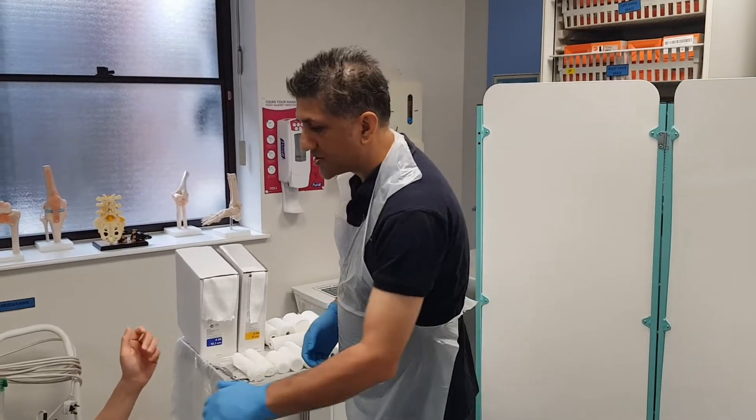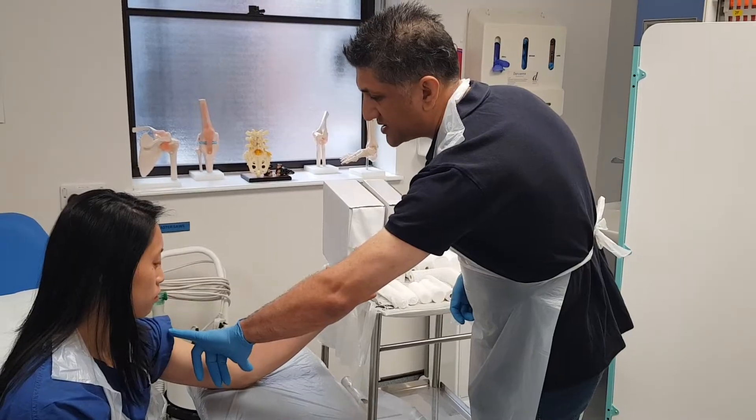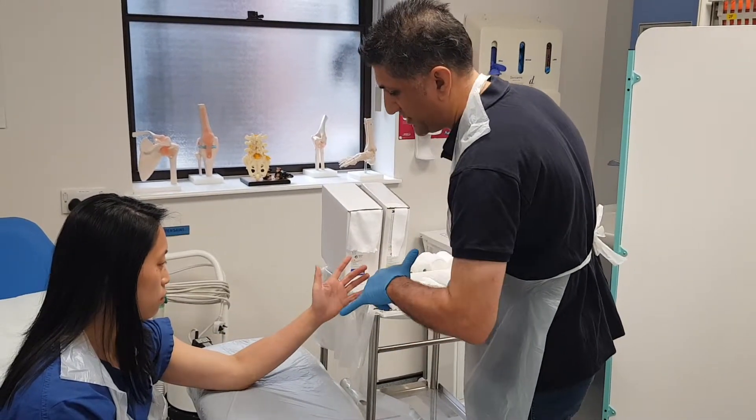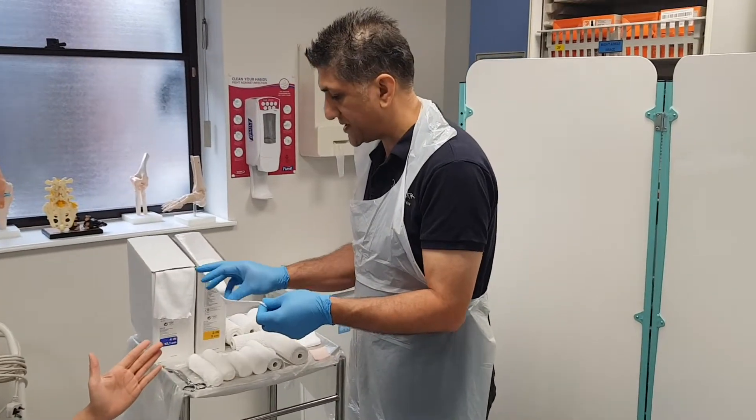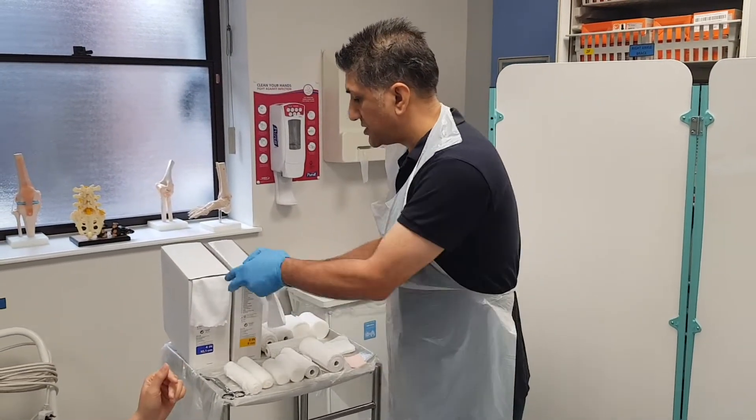We're going to measure how long our stockinette needs to be, and I think it's going to be about three hand widths. It's always better to go too long than too short.